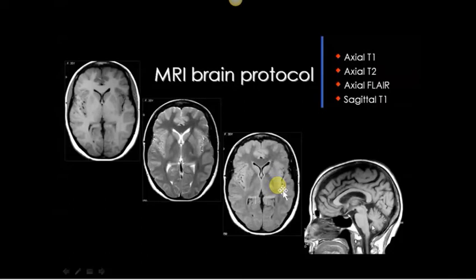To differentiate from the T2, we take a special type of image called the FLAIR image. It belongs to the T2, but the difference is that in the T2 image the fluid or CSF is white, while here the CSF is black, so that we can differentiate the pathology, whether it is due to tumor, fat, lipoma or fluid.